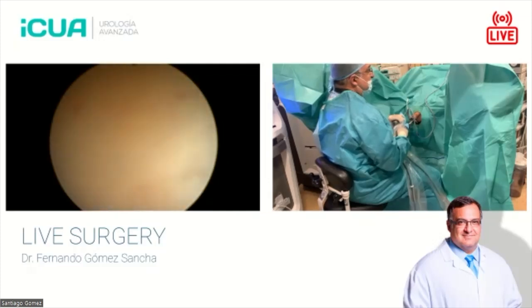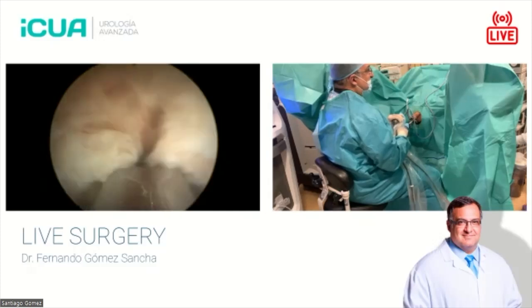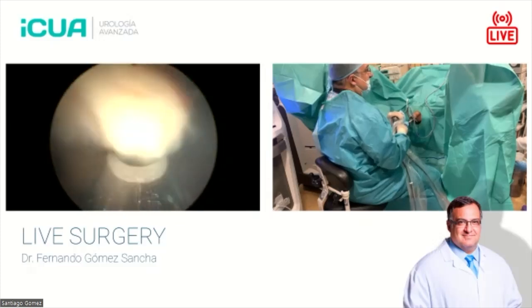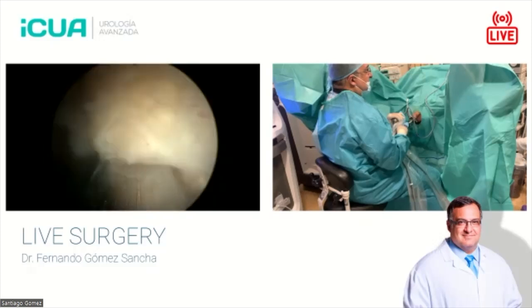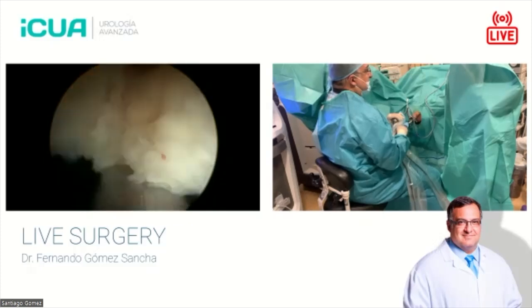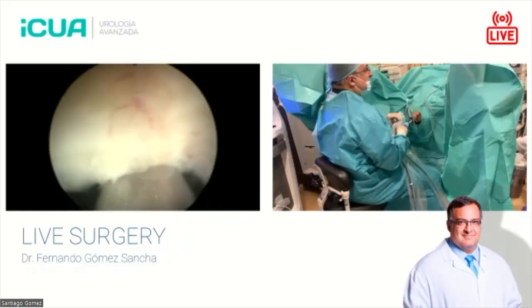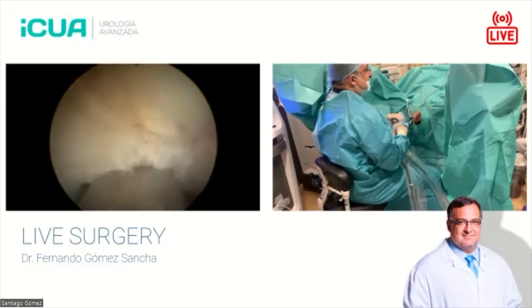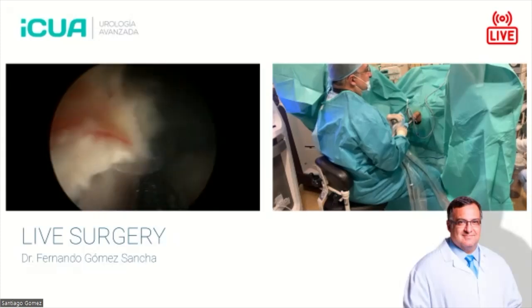Often we see little stones, but mostly when there are stones between the adenoma and the capsule, they are going to be, let's say, floating in the fossa or in the bladder floor. So it's not a very common problem, I would say. Occasionally, you have to be aware that this can happen. And if you see a stone, instead of trying to morcellate the stone, you should try to go to another area of the morcellation of the tissue.